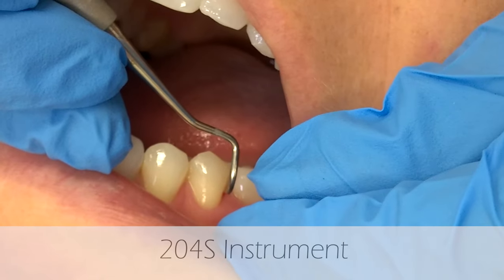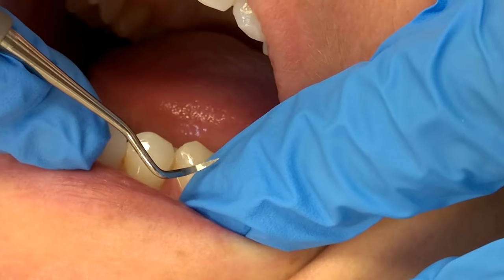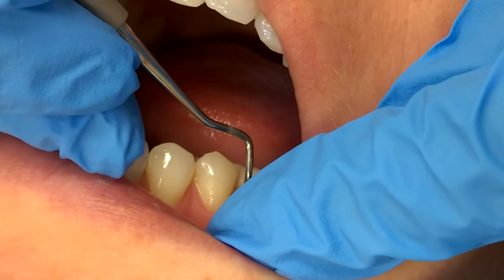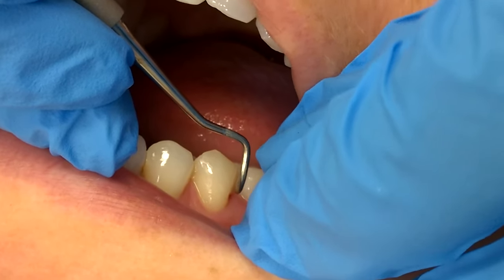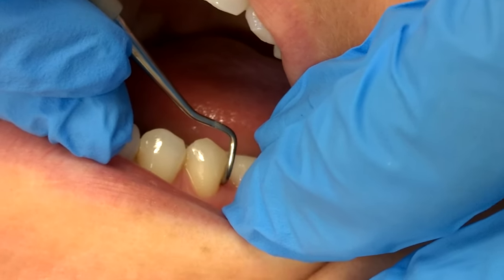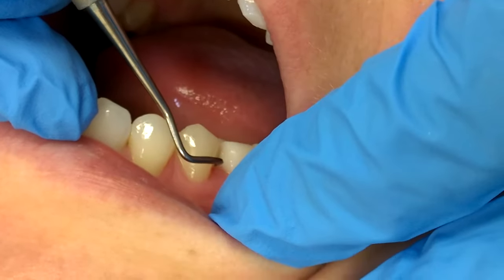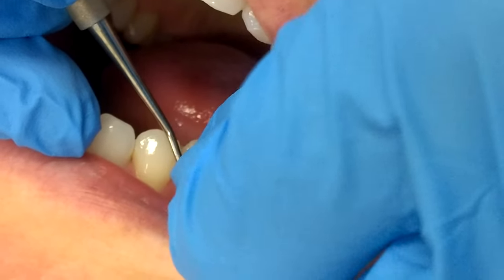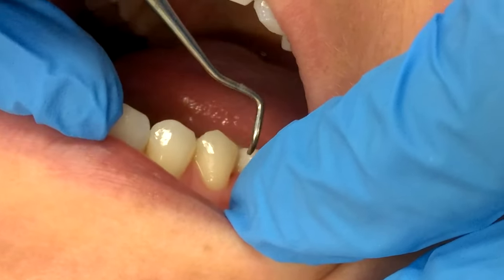I'm going to show you today how to use the 204S instrument. This instrument has a shorter shank and it also has a tip versus a toe. To get the correct working end, you want to make sure that the elbow right here is pointed towards the posterior. If I use the other end, you can see that the elbow right here is pointed towards the anterior and the shank is actually coming across the tooth — and you want that shank to be parallel.